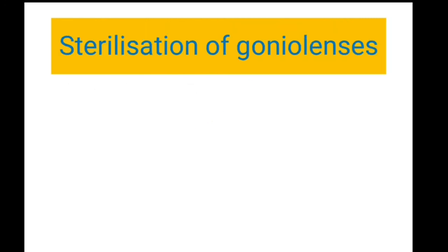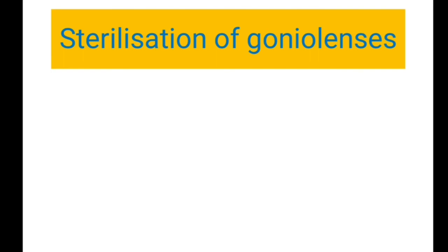After using on each patient, just keep the goniolens under flowing tap water and wipe it with lint-free cotton material. Okay, or you can use 70% isopropyl alcohol to just wipe the posterior surface of the goniolens.